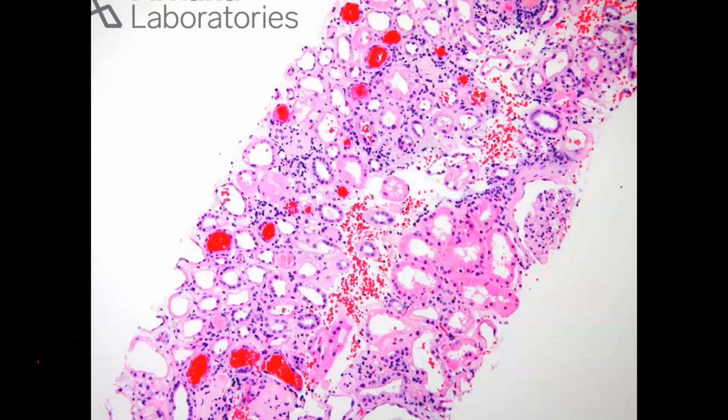renal biopsy was done after the INR settled down to normal, because of course we cannot perform a renal biopsy in patients with a high INR, like this patient with an INR of 3.27. Then we make the renal biopsy. This is a documented diagnosis.